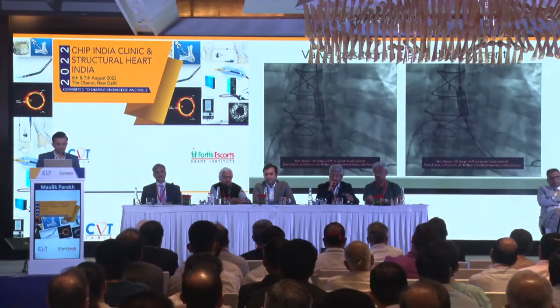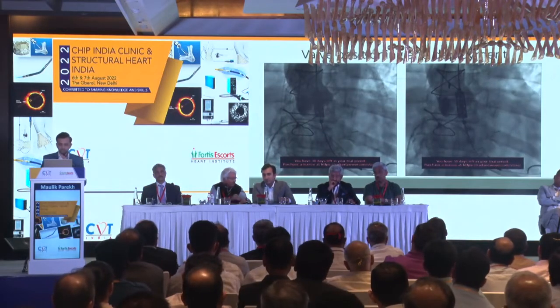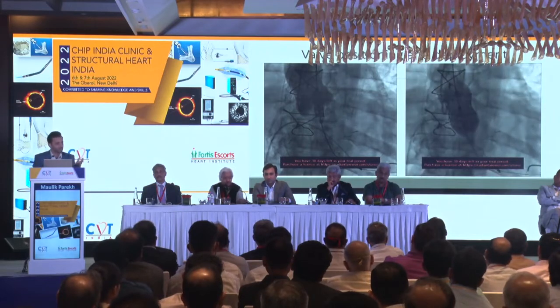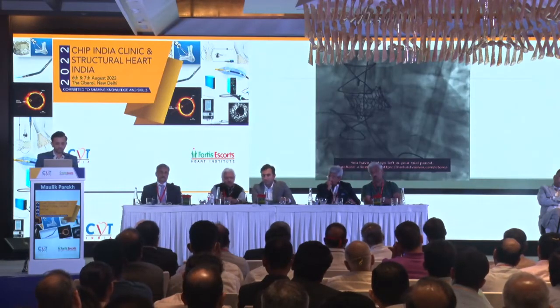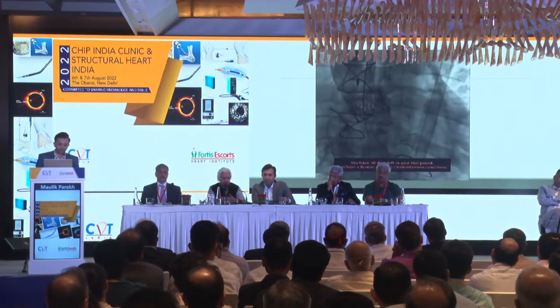Valve crossed well. Final positioning and final deployment. The lie of the valve is going to be different because you are coming from the right side. So always it's preferable to come from the left side, but we did not have much choice here. And this was the final result. Great result, good depth, no PVL.